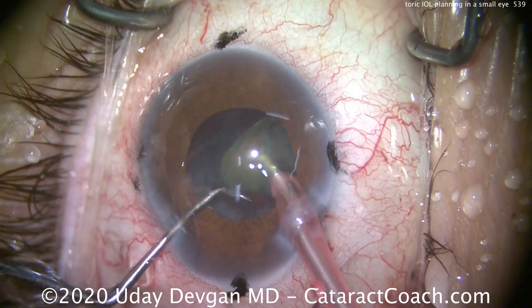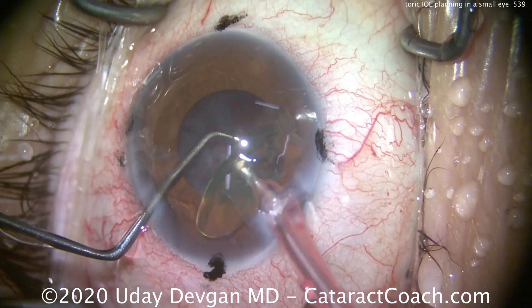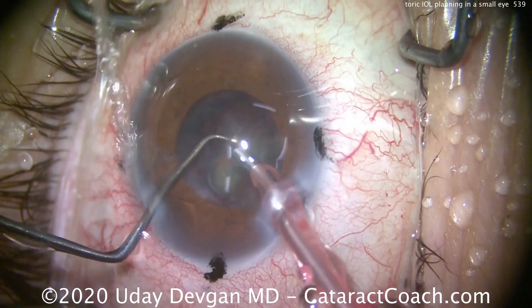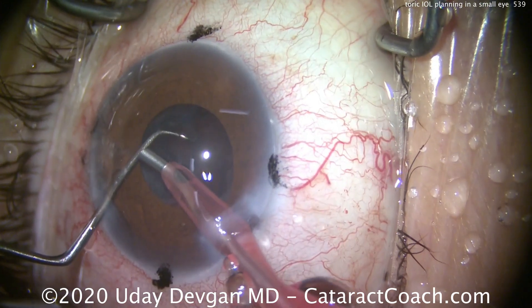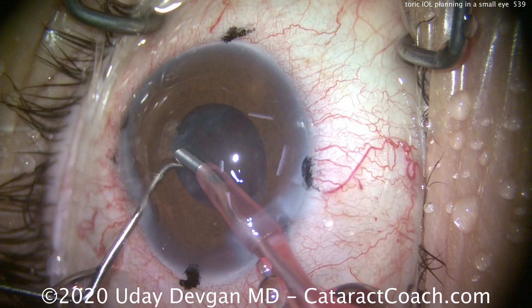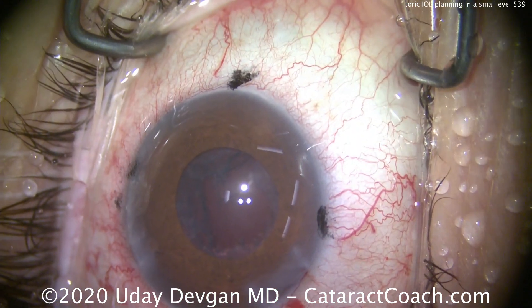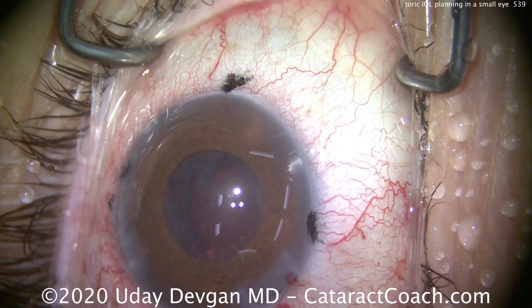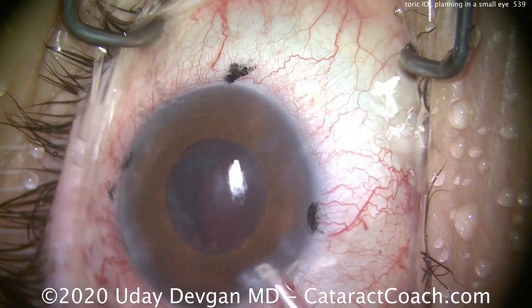Fortunately the cataract is not very dense. This patient doesn't have the best dilation — there's been a history of chronic pilocarpine use many years ago, which has resulted in this relatively miotic pupil. But luckily the 5mm dilation is sufficient for us to complete this case. We'll now use cortex removal with the IA probe and clean this up.